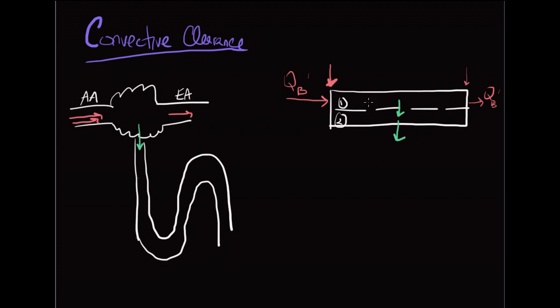It takes advantage of a pressure gradient to force fluid through a membrane into the next compartment. In the case of the filter, it's compartment 2 and then out as a waste product. In the case of the glomerulus, it's into the tubular lumen and then out as a waste product. So how do solutes come across when you're exerting a pressure difference? Convection causes solutes to travel with the fluid that's being moved. And actually that's what the definition of convection is, at least one simple definition: the movement of solutes through a solution or a fluid.